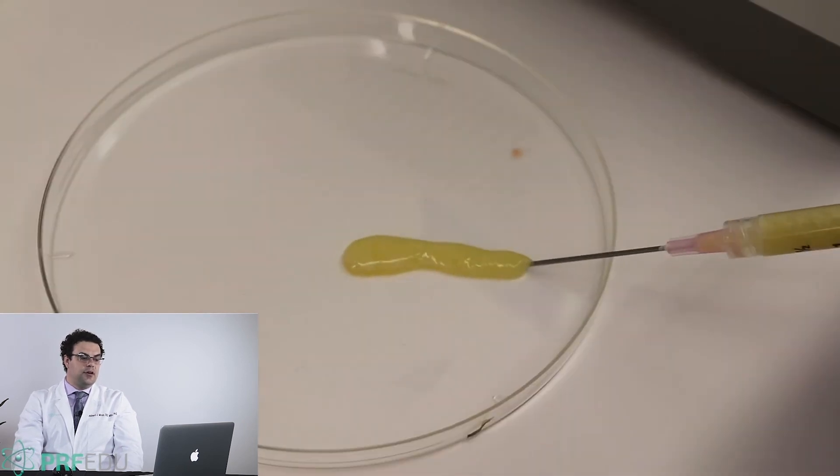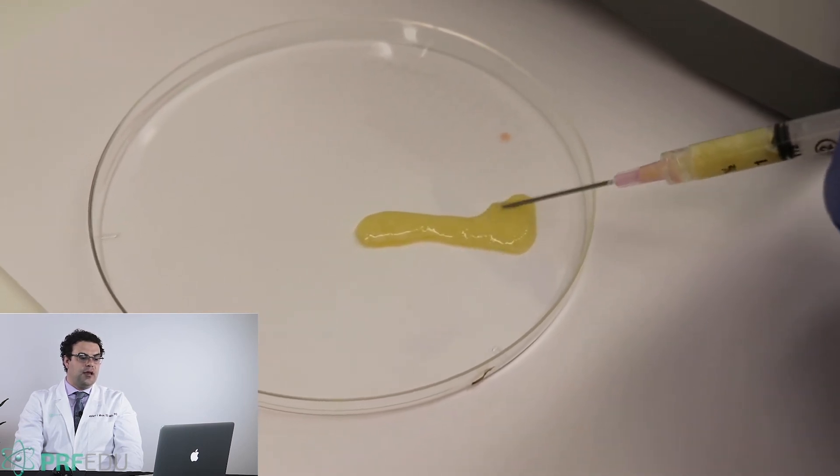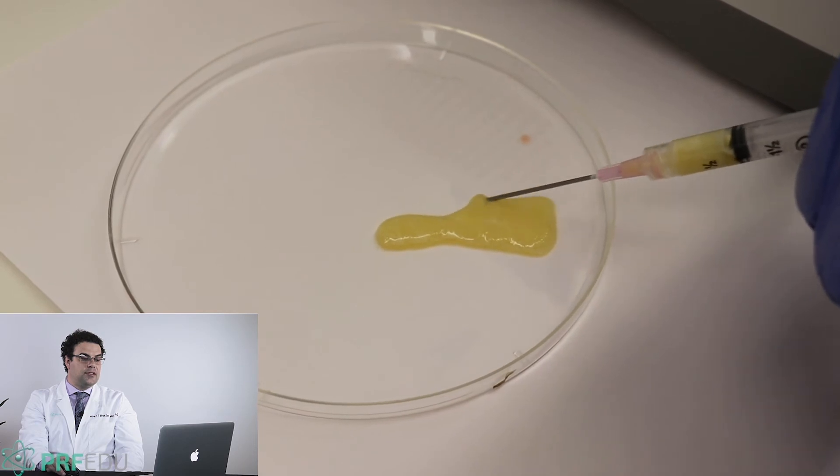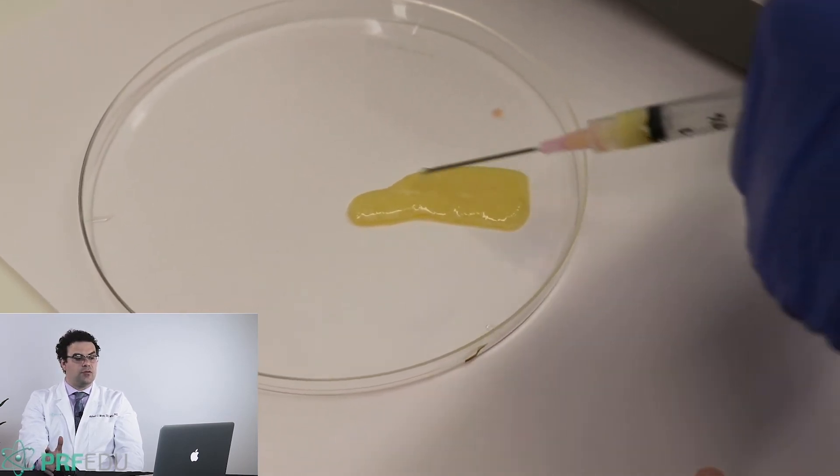Take a look at the consistency here — I'm injecting it on a plastic tray so you can see it has a completely different consistency, much more like a gel as opposed to a liquid. We have to inject with slightly larger gauge needles, but the advantage is it's totally natural and it lasts instead of two to three weeks, four to six months.